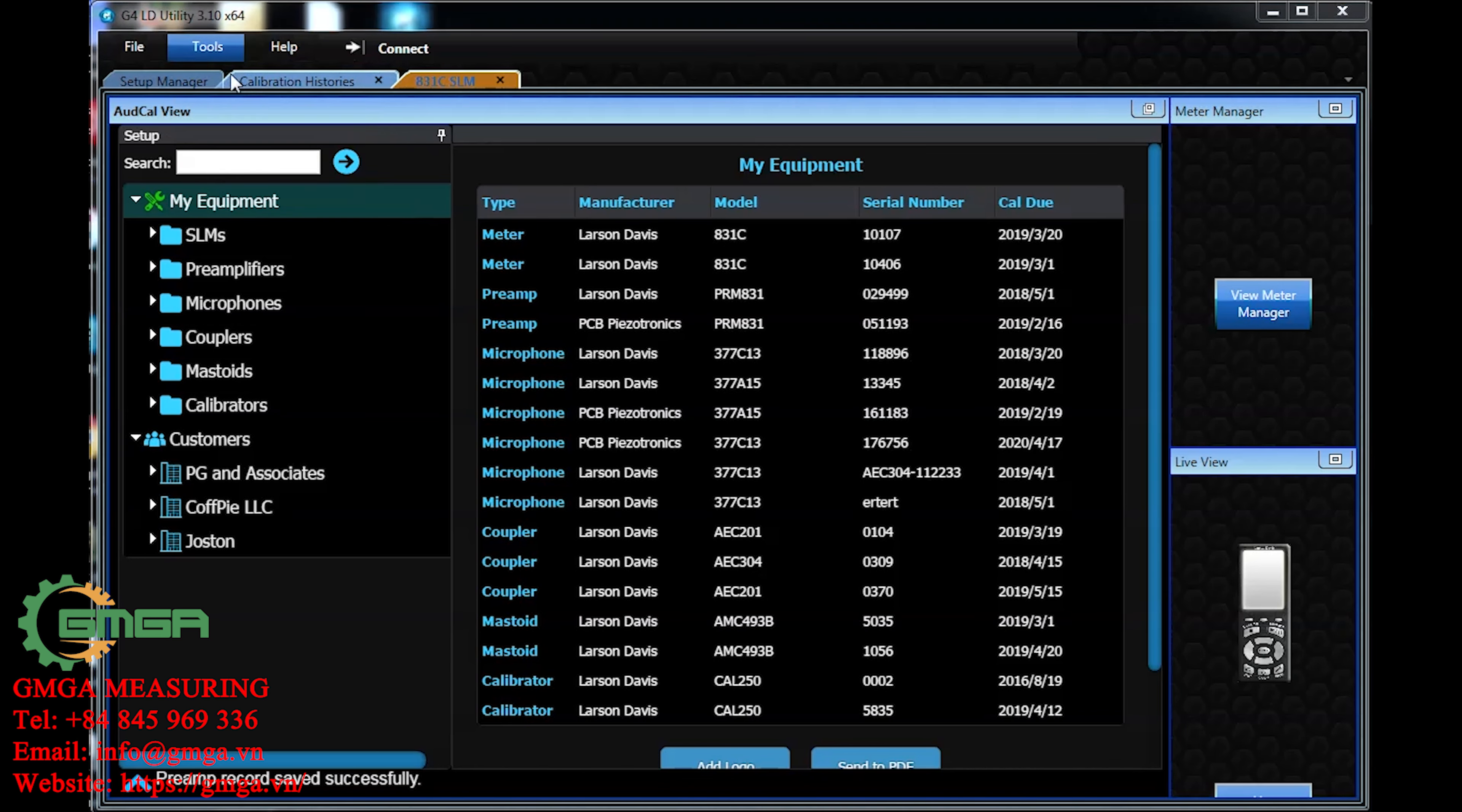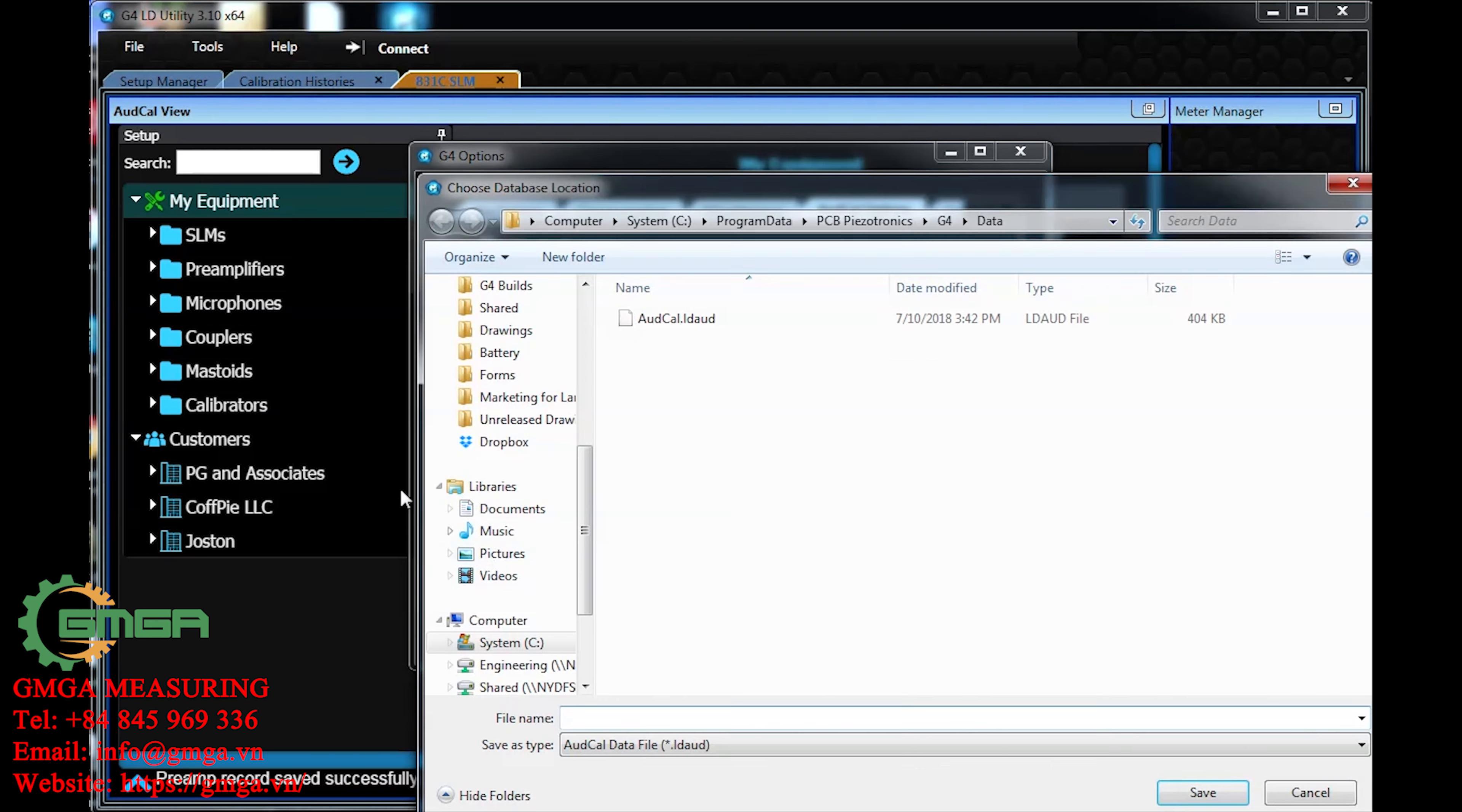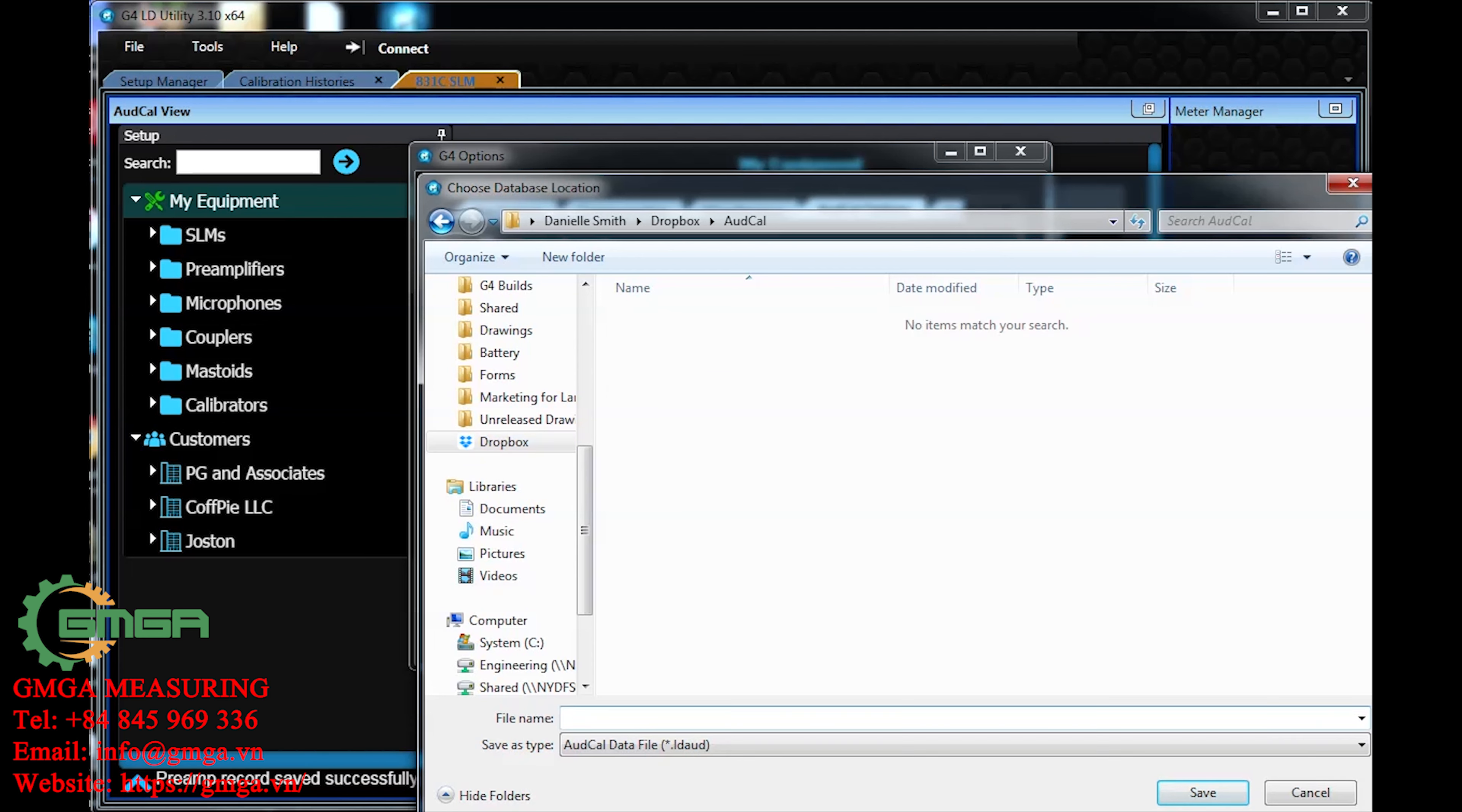The sync database can be anywhere your computer can access, including a cloud-based system. You can update the sync database file from anywhere.